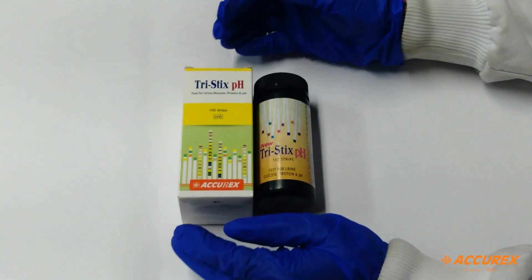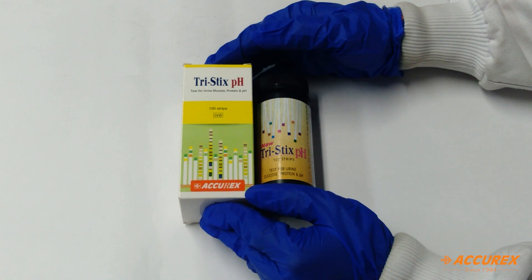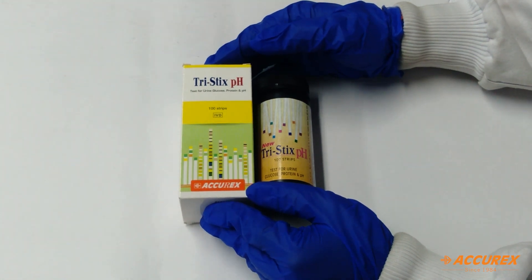Hello everyone, today we will see Acurex Triastics pH. In this we can detect glucose, protein and pH in urine sample.